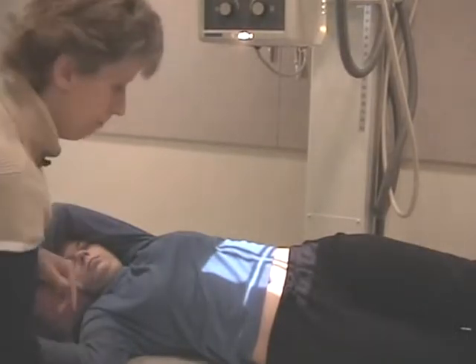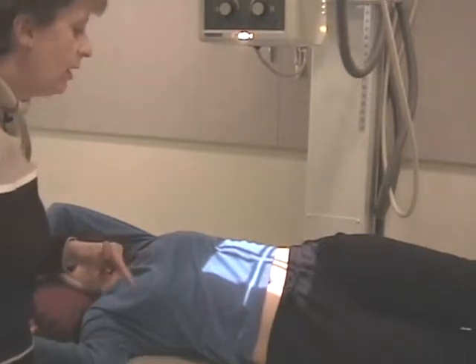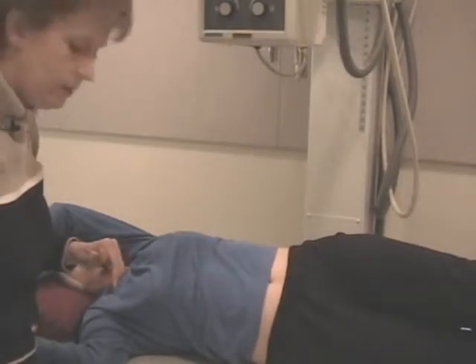Okay. I'm using a right marker because this is demonstrating the right side. This will actually demonstrate the right zygapophyseal joint.